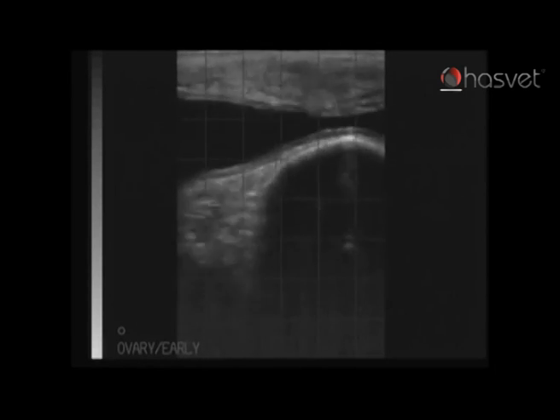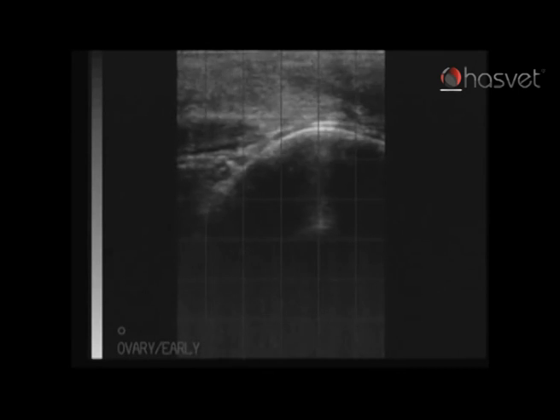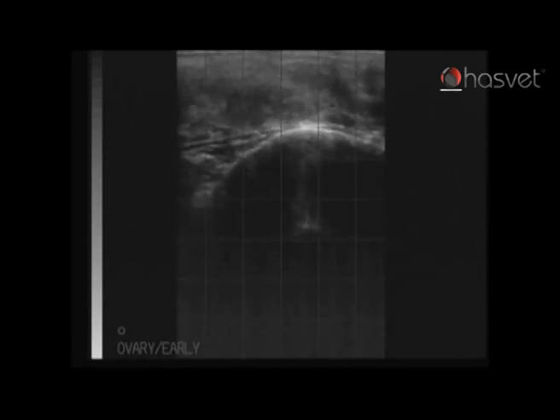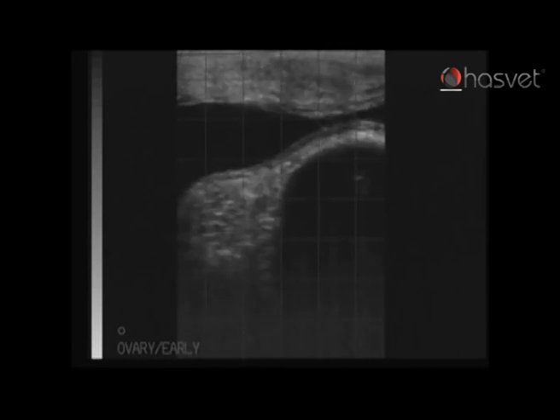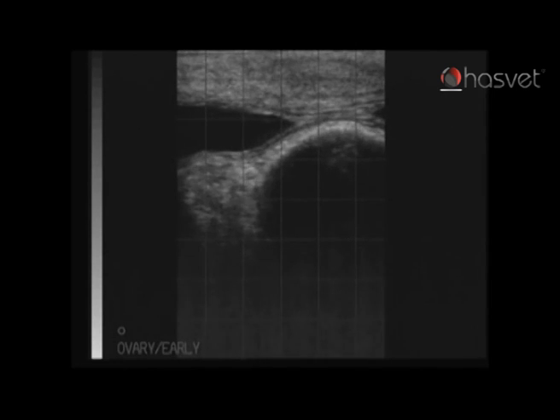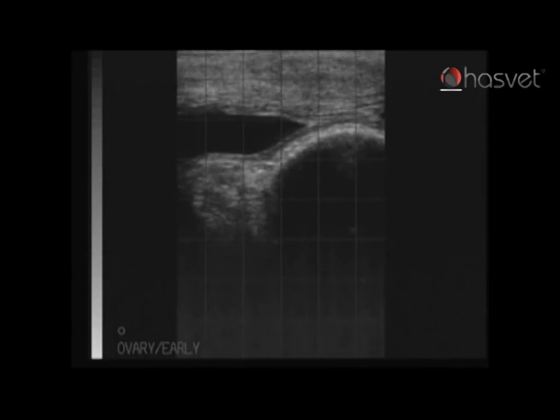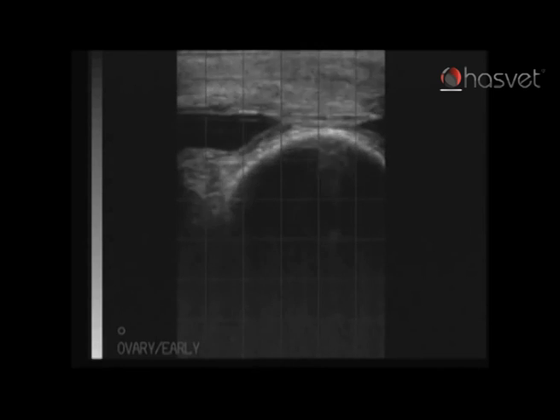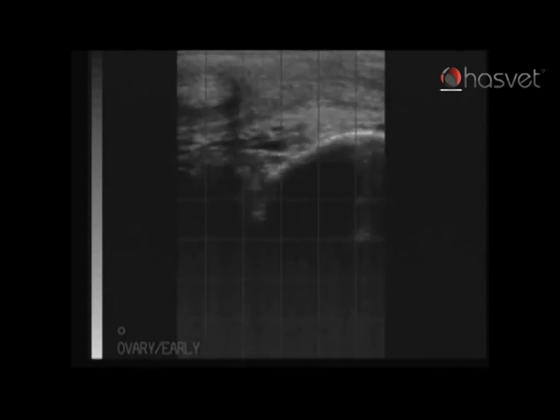To confirm pregnancy in this cow we would ideally like to visualize four specific features: a corpus luteum on the ovary, the presence of fetal fluids within the uterus, the presence of fetal membranes, and finally the fetus itself.